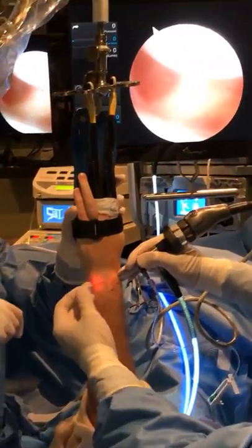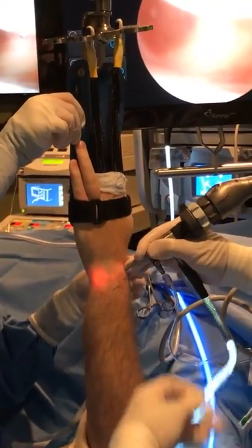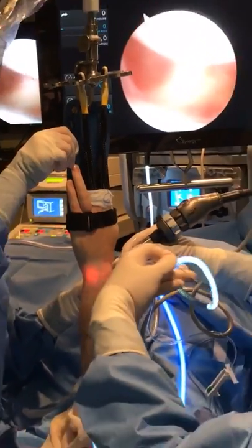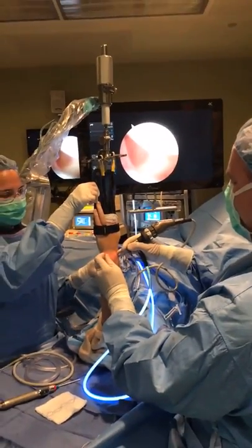So the wrist is transilluminating because of the fiber optic. Kate, this is a cord that you like, right, Kate? Yes. It's like the disco cord. She likes this one. It's my favorite.